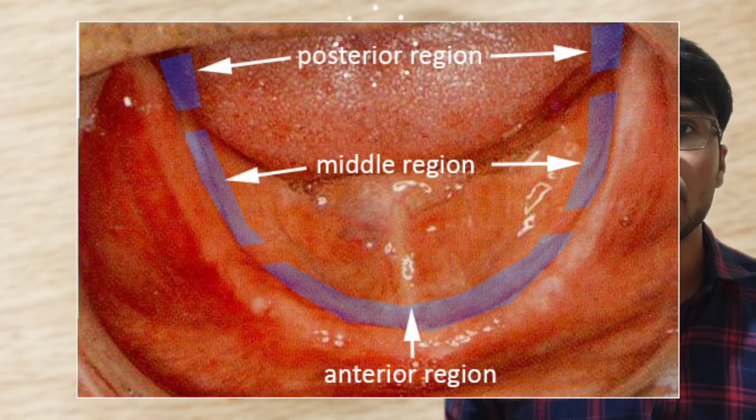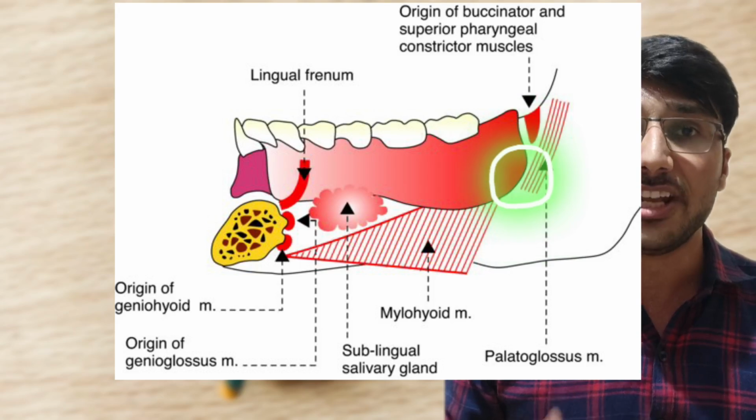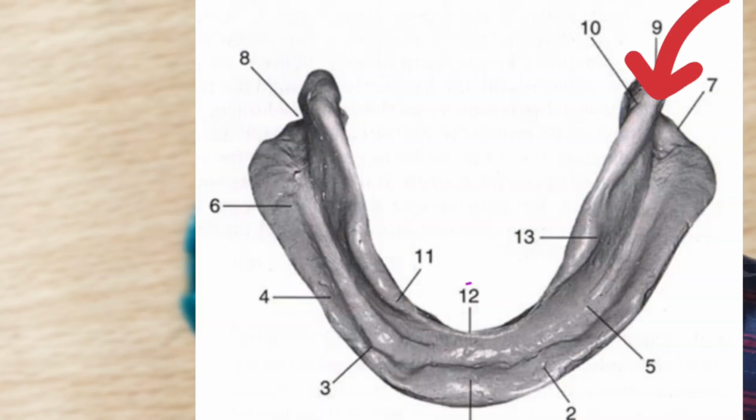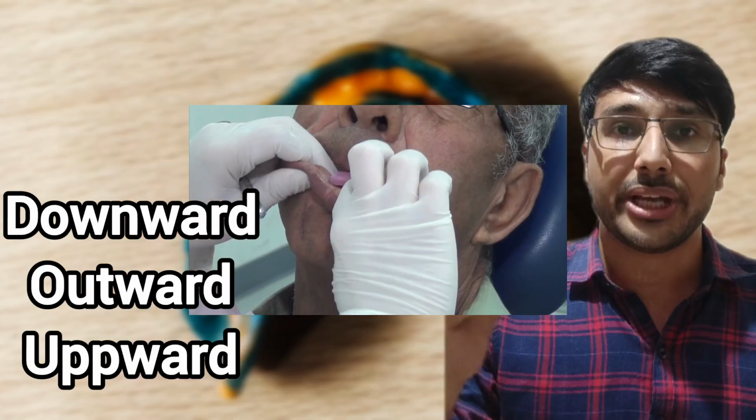In the posterior region, the flange passes into the retromylohyoid fossa. As it does, it is no longer influenced by the extent of the mylohyoid muscle, and so the flange can turn laterally toward the ramus to fill the fossa and complete the typical S shape of the correctly shaped lingual flange. Then do border molding of the labial and buccal sulcus by downward, outward and upward movements.